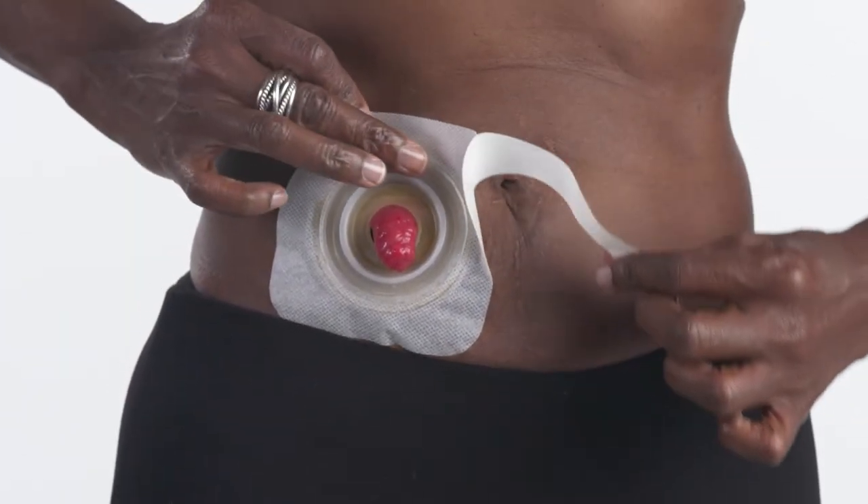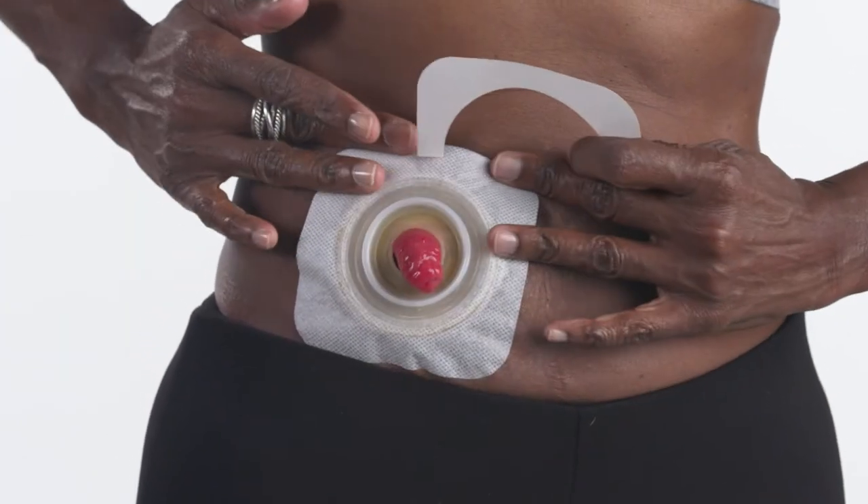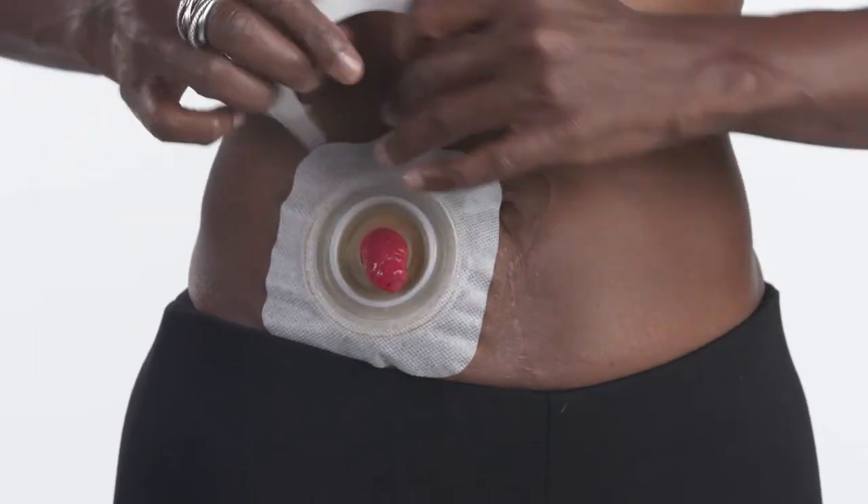Remove the release paper from the fabric collar and press against your skin, smoothing out any wrinkles.